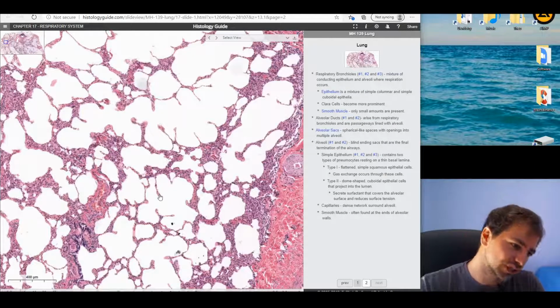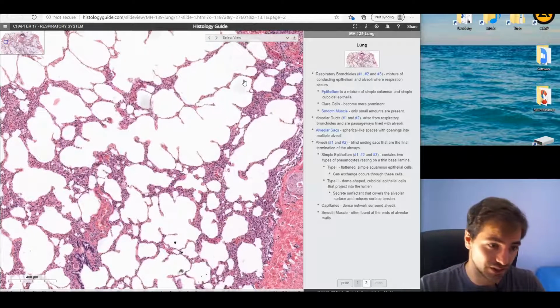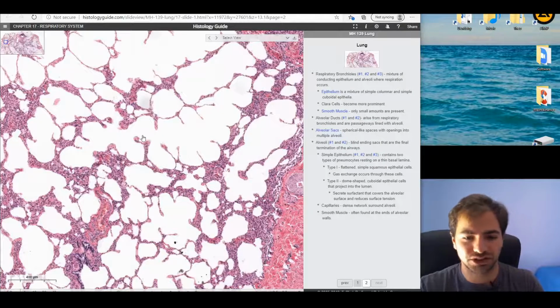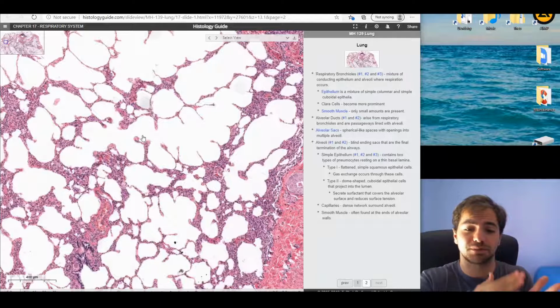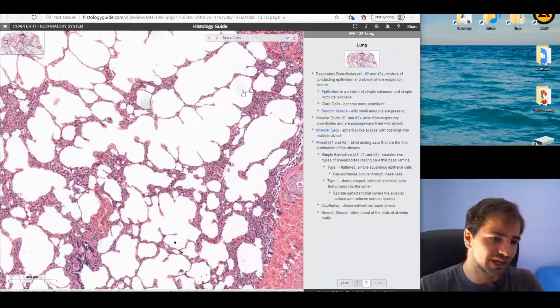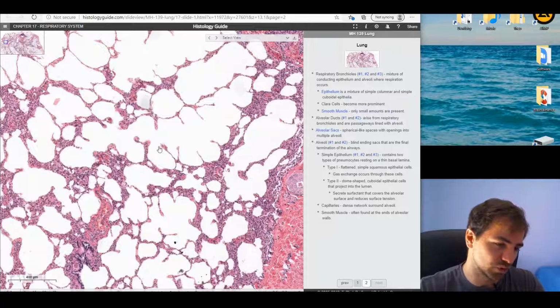So if you start seeing portions and branching outs of a few branches within this area, this should be a sac. Now, if you see bigger areas, for example, this one right here, this should be the alveolar duct. But the logic is exactly the same. It's going to be covered with simple squamous epithelia, lined out throughout the whole layer. Distinguishing between the sacs and the ducts is only a matter of size, a matter of the opening of the lumen and diameter, the lucent area.